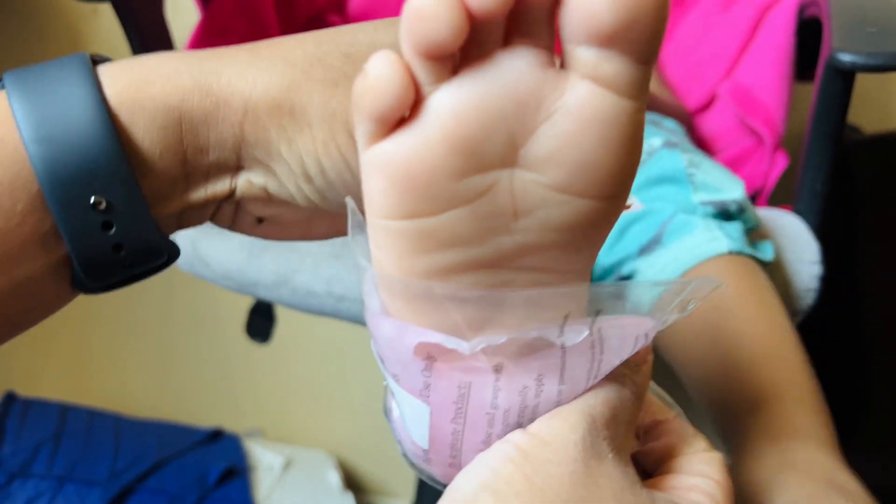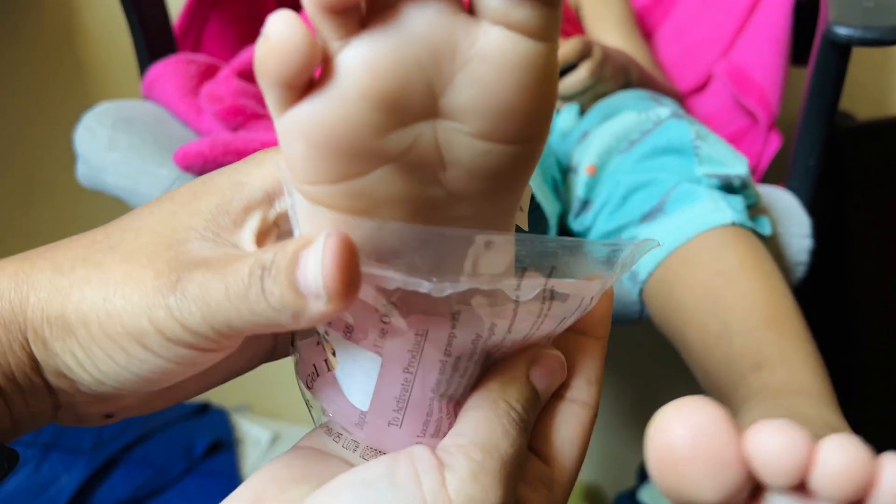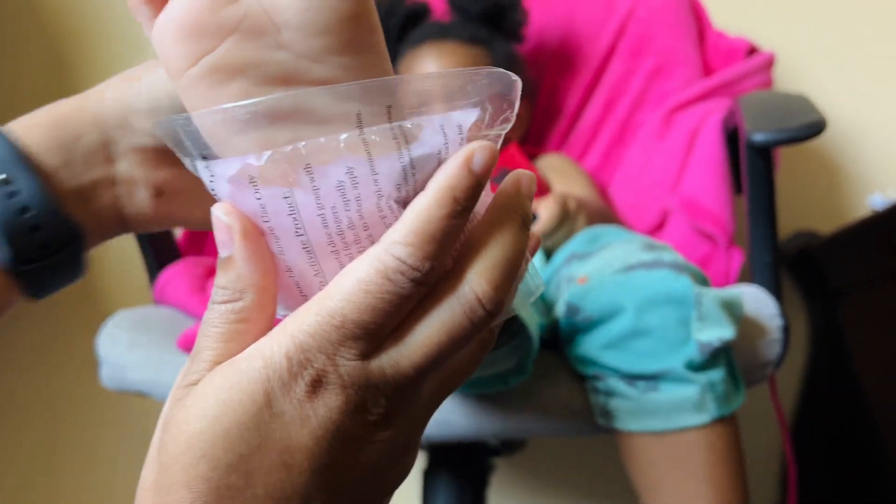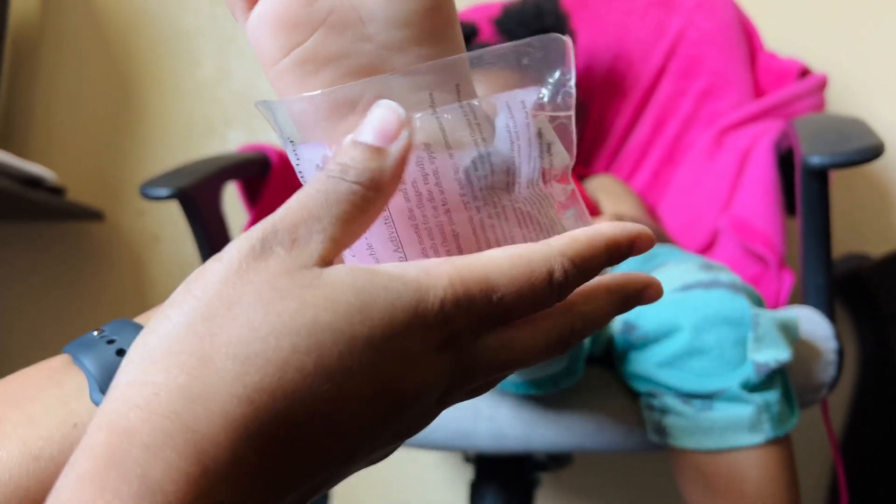Make sure you have your gloves on before performing this procedure. When going into the NICU or nursery, always verify your patient by name and date of birth — check the baby's tags on the ankle to confirm you have the right patient. After activating the heel warmer and it starts to warm up, place it onto the baby's heel and secure the strap so it fits snugly like a little flip-flop.